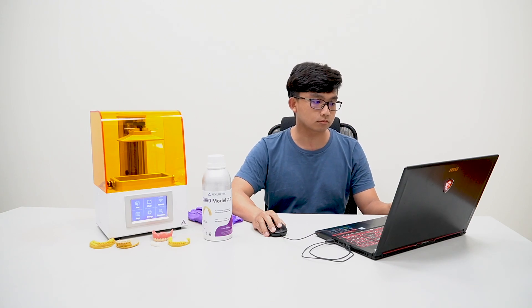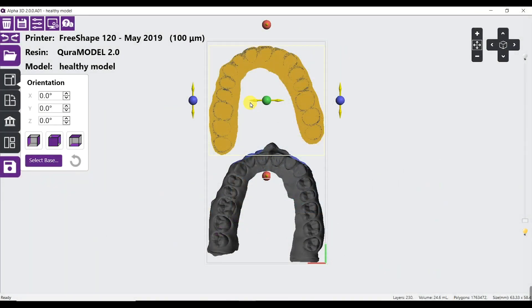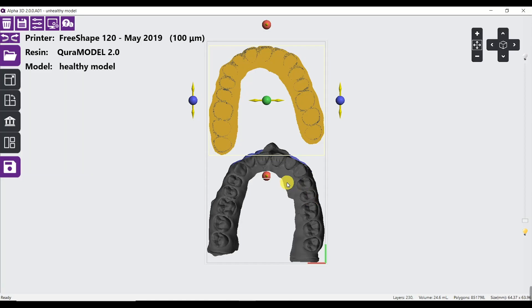Before we start the print, there are a few things I check to ensure the print will come out successful. Is the model healthy or not? A healthy model will be shown in yellow colors, which has a flat bottom surface.